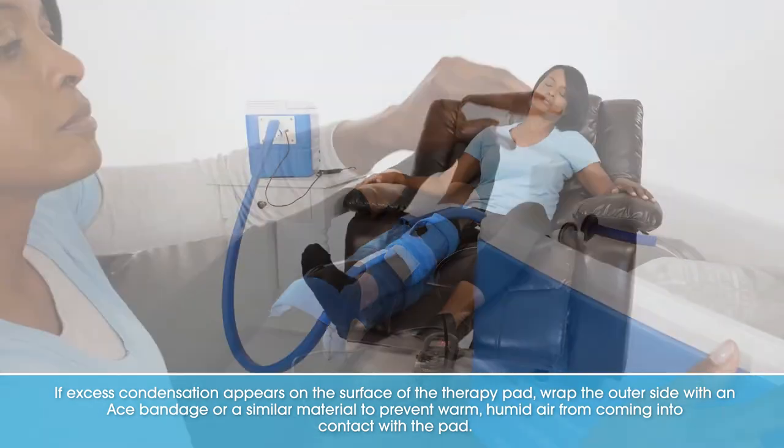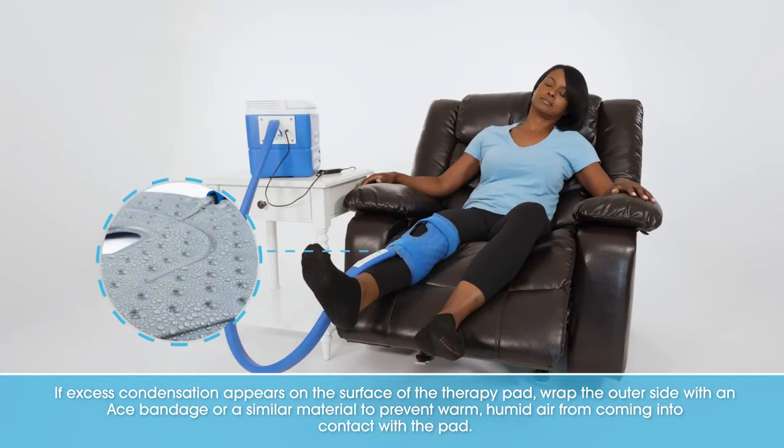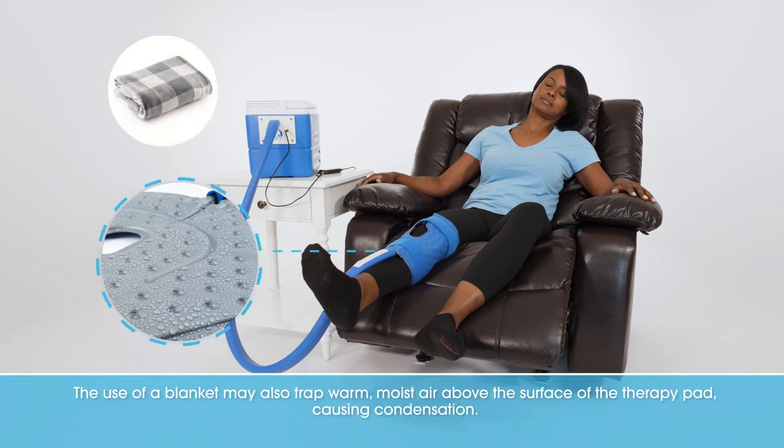If excess condensation appears on the surface of the therapy pad, wrap the outer side with an ACE bandage or a similar material to prevent warm, humid air from coming into contact with the pad. The use of a blanket may also trap warm, moist air above the surface of the therapy pad, causing condensation.